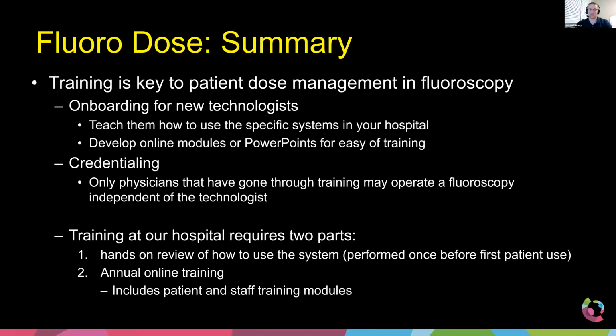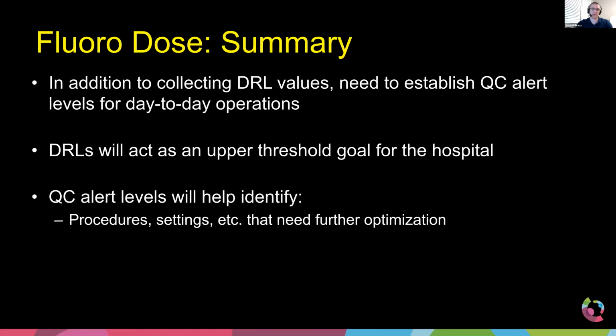This requires hands-on training, a class of at least an hour where they're taught all the buttons and how to reduce dose and all the stuff we've talked about. And then annually they have to do an online module. If they're not credentialed, that's fine. They can still be in the room and tell the technologist beam on, beam off, move this, do that. The technologist just runs the machine.